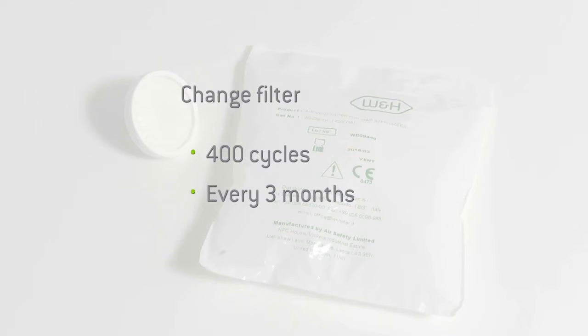By replacing the filter, you ensure your steriliser has a component that remains effective at filtering the air which passes through it. If the bacteriological filter is heavily discoloured with dust, it should be replaced immediately.